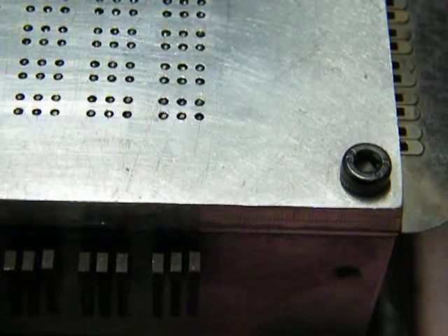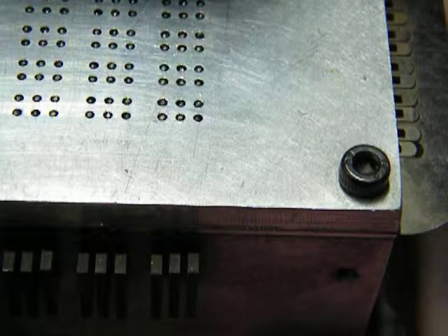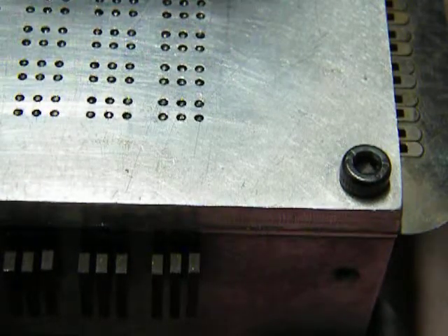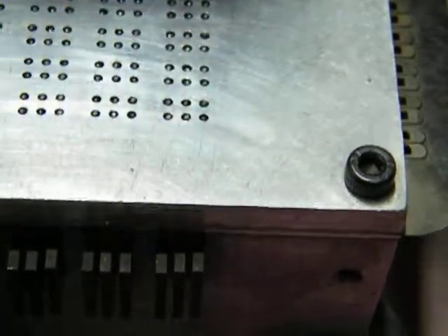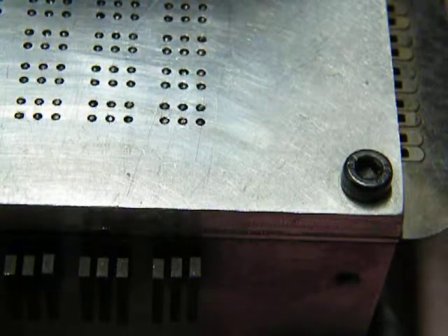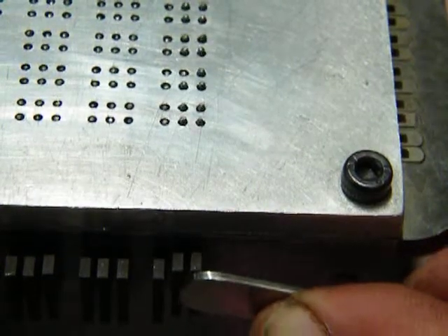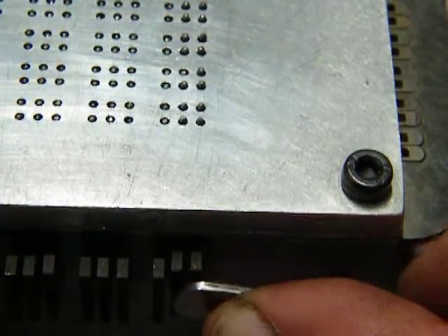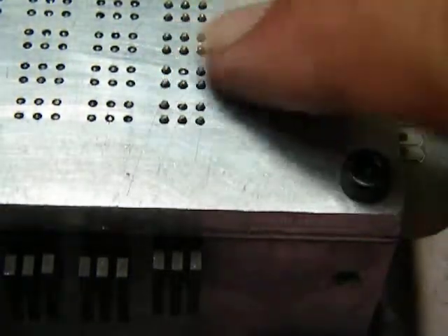of movement, just about half a millimeter. That is latched and open. Open and latched, so you have very little movement, just half a millimeter is enough to latch and open. So basically when it's open and you look, all the pins get kicked up. So I've got all the pins up in the cells here.